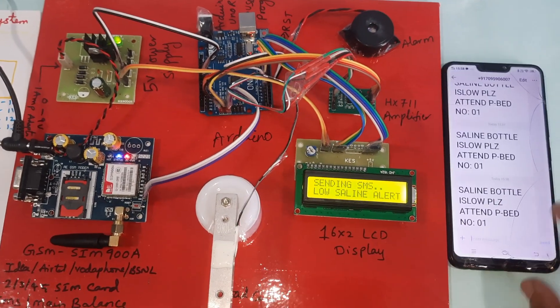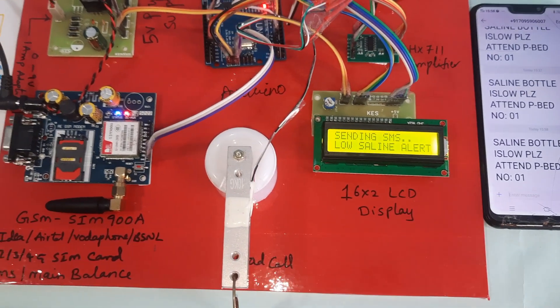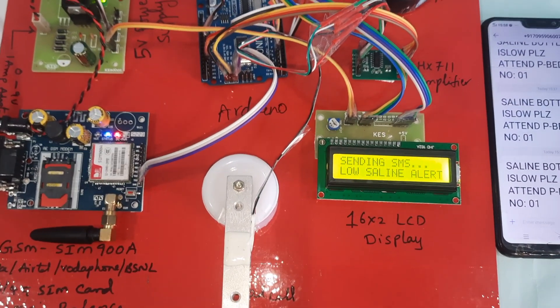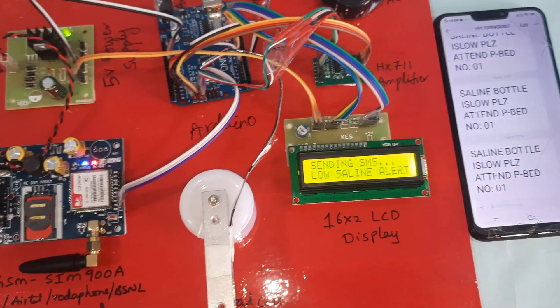SMS received. Message reads: 'Saline bottle is very low, please attend the patient, bed number 1.' Three SMS alerts were sent in total — one to the demonstrator and two to students as alert notifications.